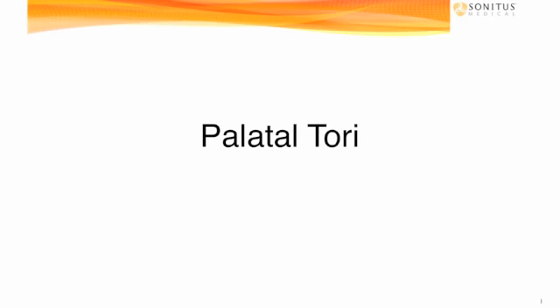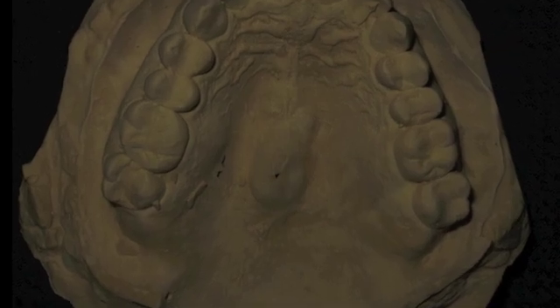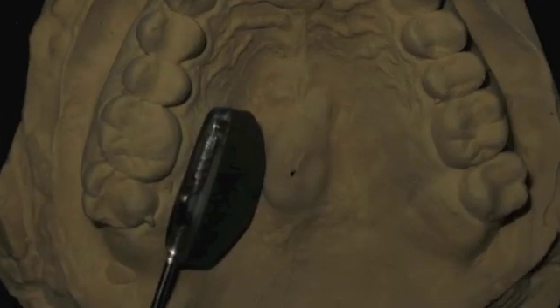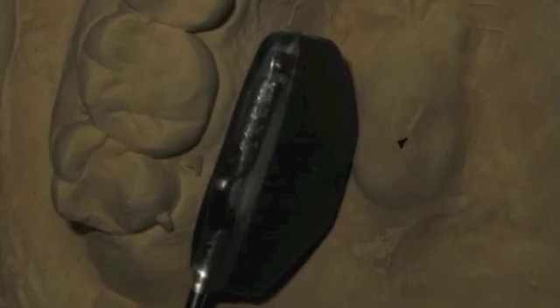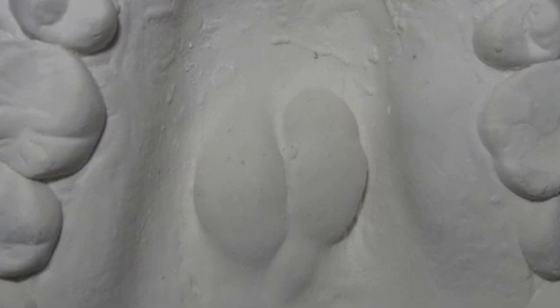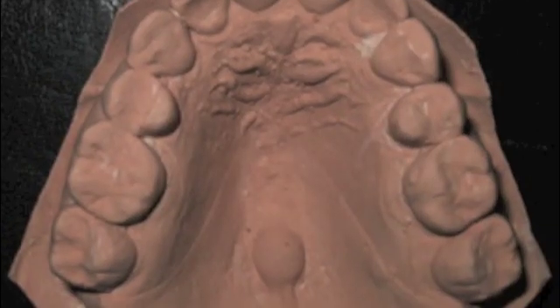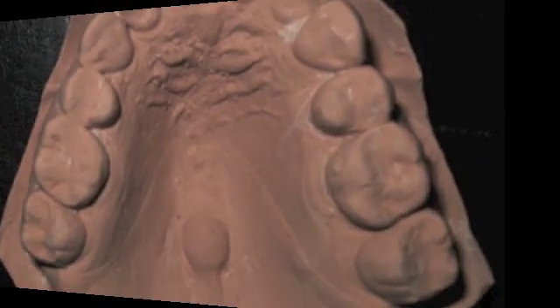Now let's talk about palatal tori. Tori offer a few challenges that other parts of the anatomy don't. Namely, it's a big piece of bone up on the roof of the mouth that interferes with the battery. Notice here on this cast, the battery barely fits. Here's a very large tori in which we would never be able to get the battery to fit. And then there's also a very small tori like this one, so that tori would not interfere with it.